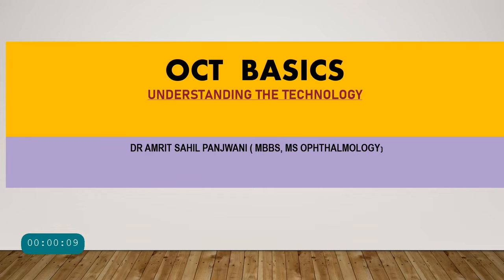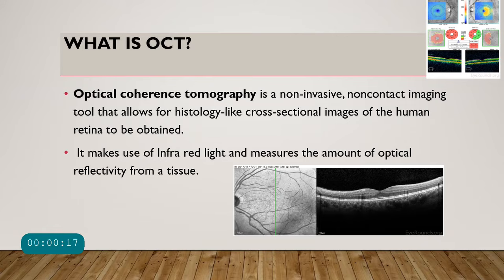Today we are studying OCT basics, and here we shall be focused on understanding the technology of OCT. So what is OCT? OCT stands for Optical Coherence Tomography. It is a non-invasive, non-contact imaging tool that allows for histology-like cross-section images of the human retina.